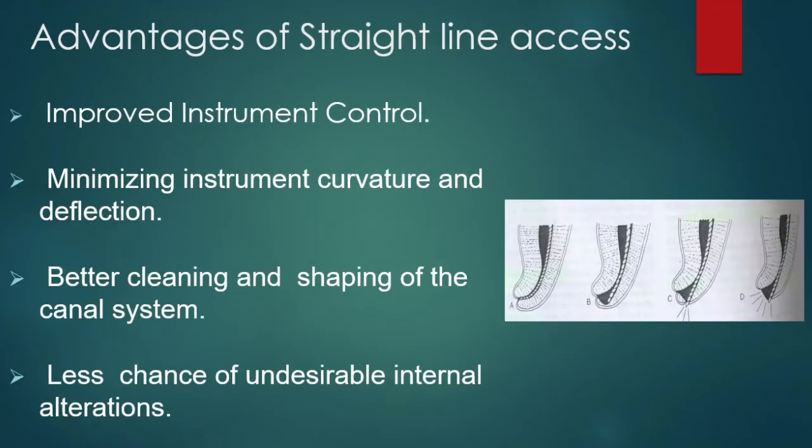All right, now what are the advantages of straight line access? First of all, improved instrument control. Number two, minimizing instrument curvature and deflection. Number three, better cleaning and shaping of the canal system. And lastly, less chance of undesirable internal alterations.